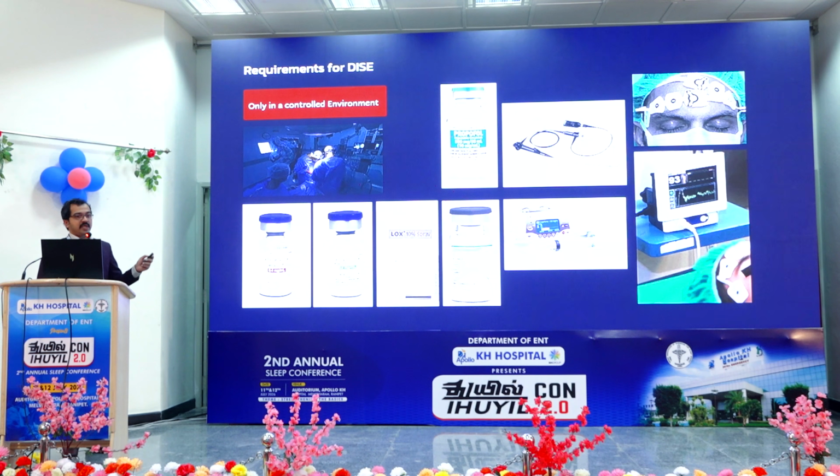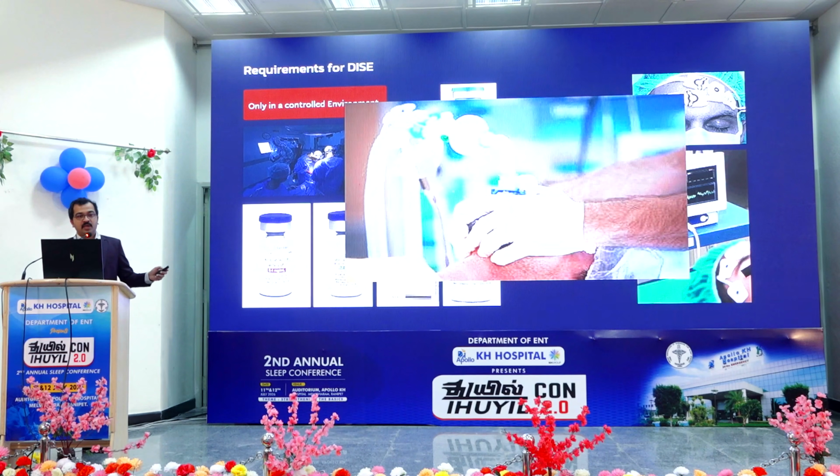And the most important is a BIS monitor, bispectral index monitor, which will help us know the depth of the sedation. Okay, the EEG waves we are picking, and based on that we know the depth of the sedation. And the most important thing is a brave anesthetist. Okay, you always form a team with a single anesthetist who is brave enough, so that when the airway collapses, he can take over it.